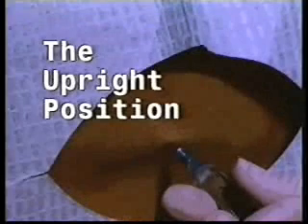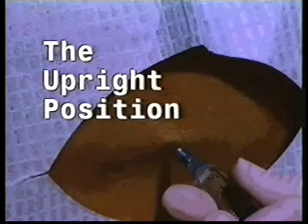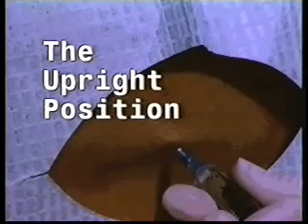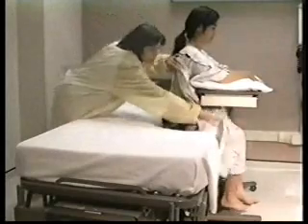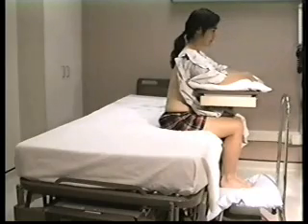The advantage of using the upright position is in the ease of access to the landmarks and site with minimal need for patient cooperation. Patients who are obese, have breathing disorders, or who have obscured landmarks may benefit from this position. Place the patient upright, preferably leaning against a table. Make sure the table can't move. Give the patient a pillow for comfort. Be sure that the patient's shoulders and iliac crests are perpendicular to the spinal column. A foot support and pillows may be needed to elevate the feet. Your objective is to create the fetal position with the patient upright.